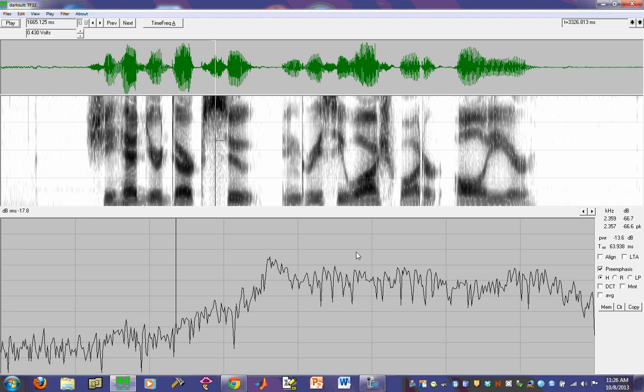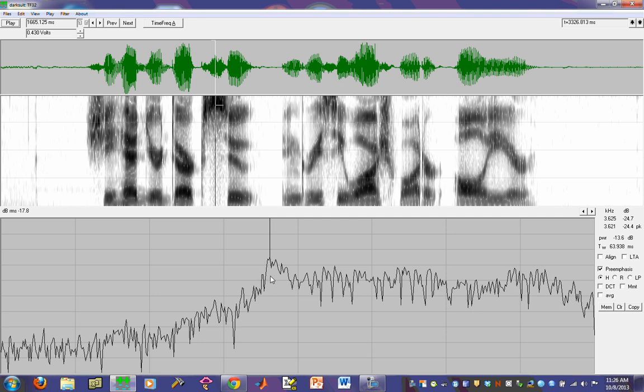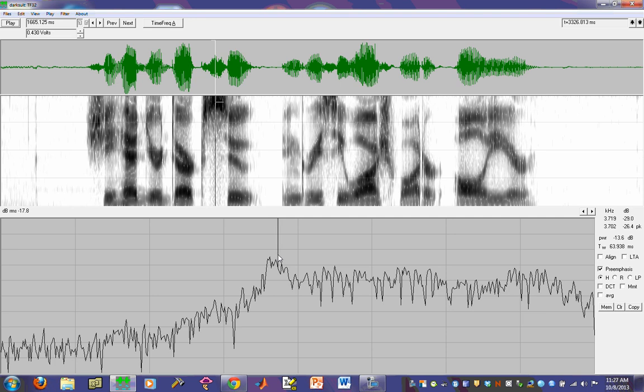And then on the right here, it's identifying the dB level at that particular frequency. So, as you can see as we are moving along, the dB level is going up. The second pair of numbers here are based upon identifying local peaks in the actual spectrum. And so, this is useful if you're trying to find a very specific peak. As you slide by, it will identify that peak, and until a larger peak comes by, you will see that it doesn't change.